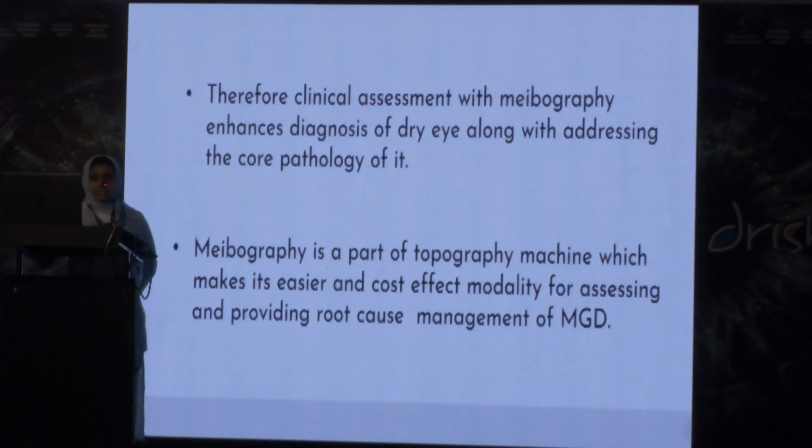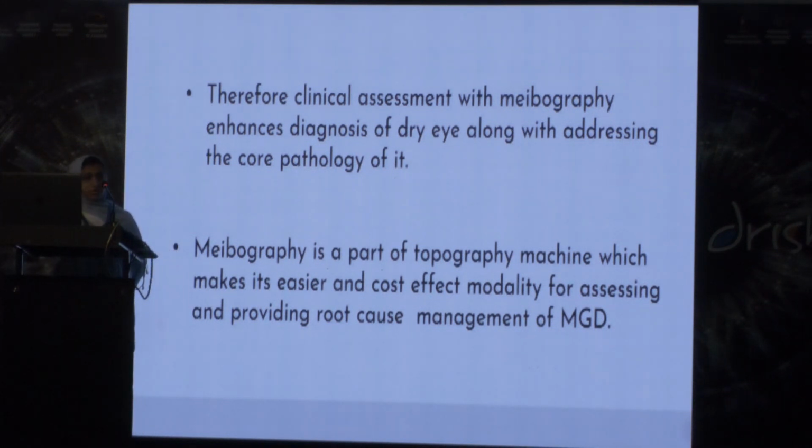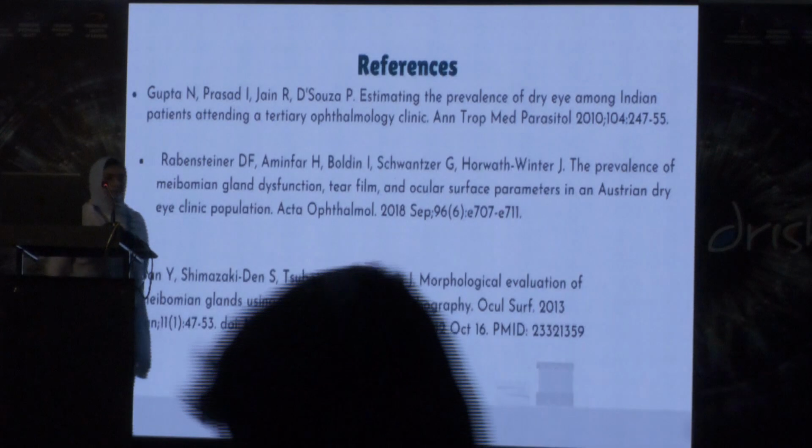Now, the meibography machine is a part of the topography machine, and it is also a part of other machines, so it is easier to undergo this test and it is cost effective. Thank you, and these are my references.